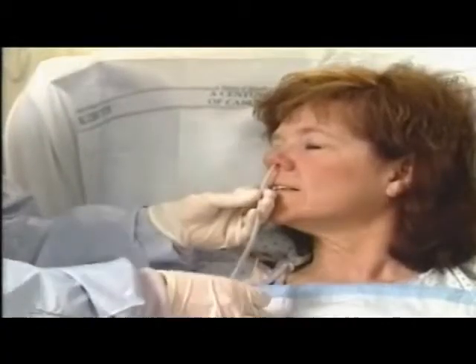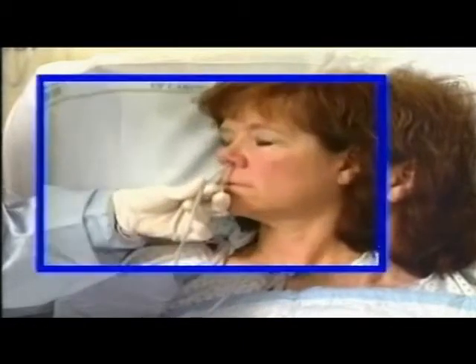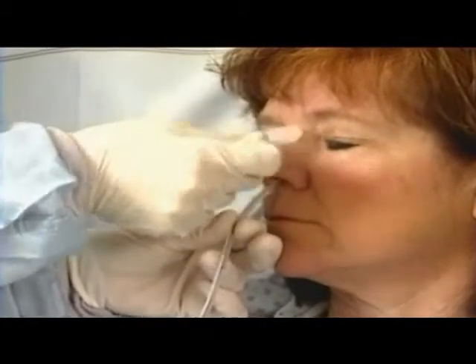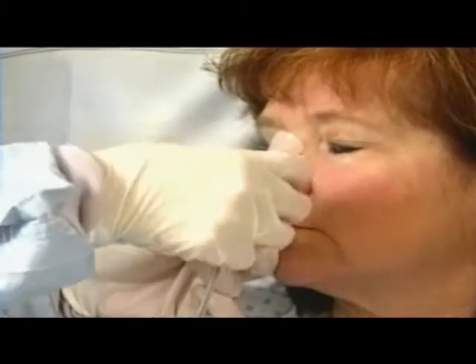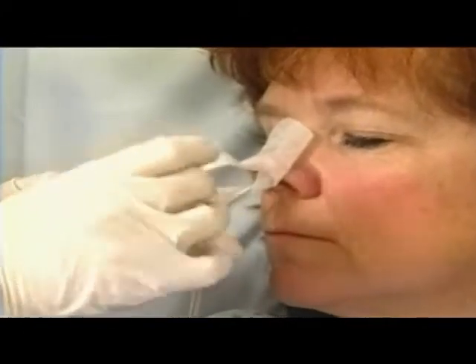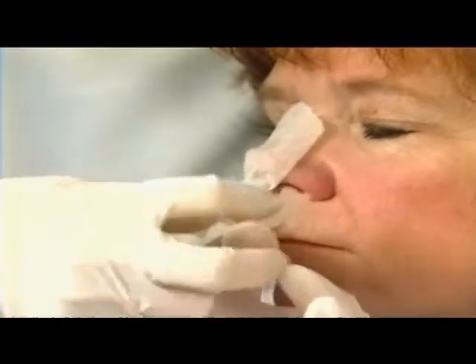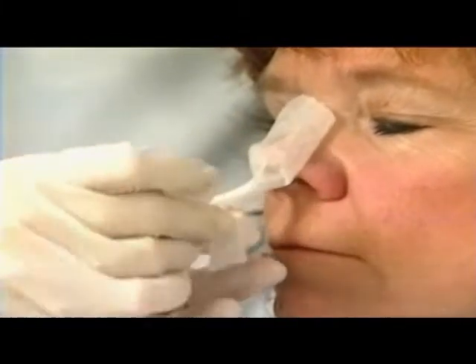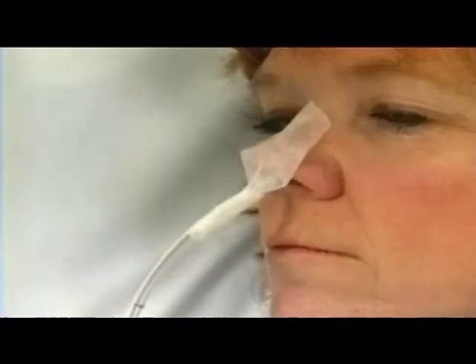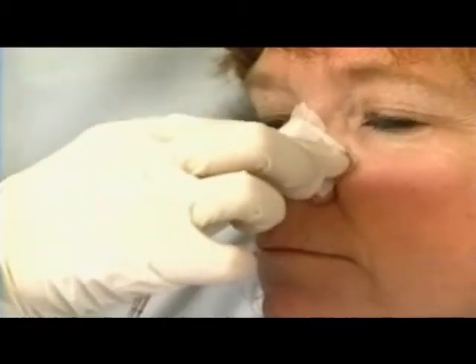Remove the tape marker and anchor the tube with the attachment device or split tape.